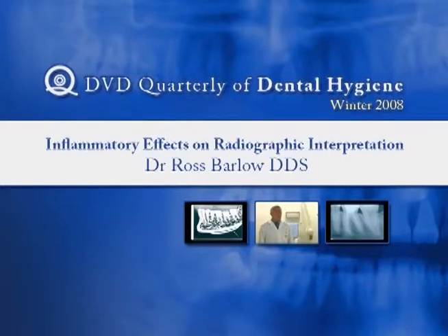Inflammatory Effects on Radiographic Interpretation is presented by Dr. Ross Barlow, Assistant Professor, Department of Oral Maxillofacial Radiology, Faculty of Dentistry, University of Toronto. I'm Dr. Ross Barlow, Assistant Professor, Department of Oral Maxillofacial Radiology at the University of Toronto, Faculty of Dentistry, and I'm the co-head of the undergraduate program in radiology.